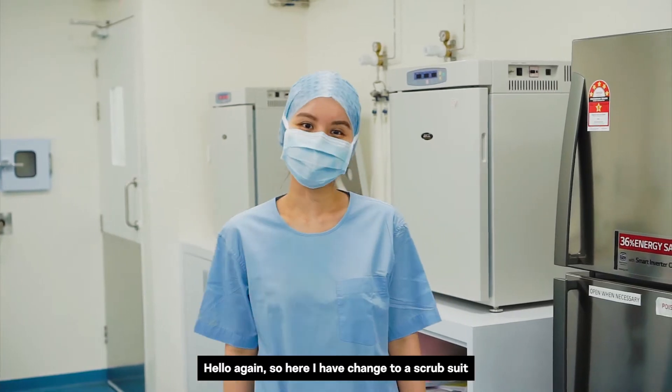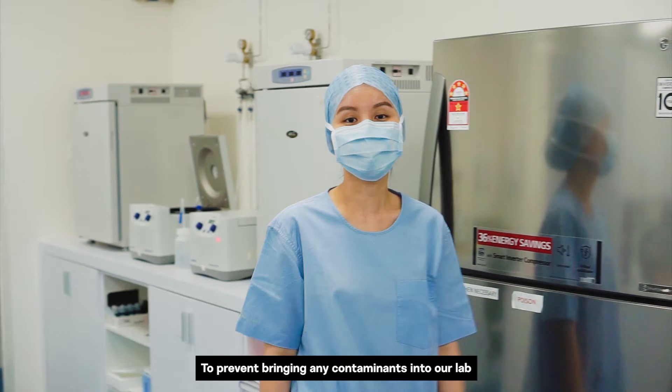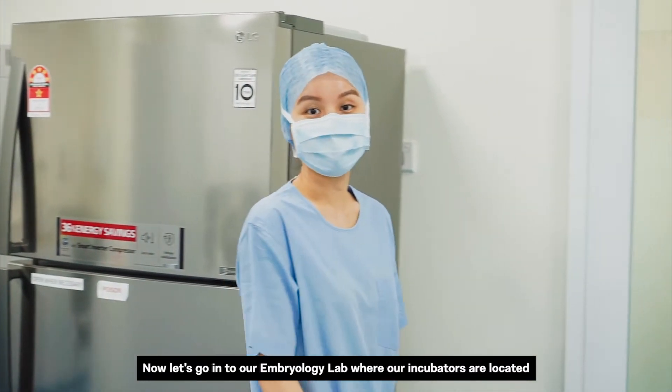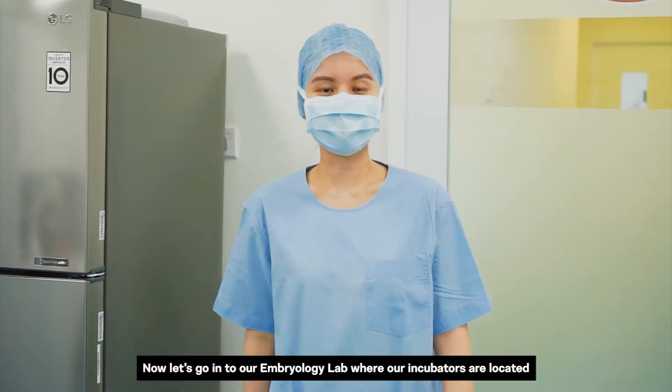Hello again. I have changed into a scrub suit to prevent bringing any contaminants into our lab. Now, come let's go into our embryology lab where all our incubators are located.